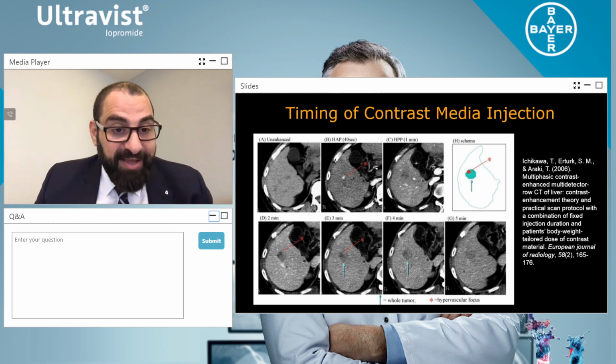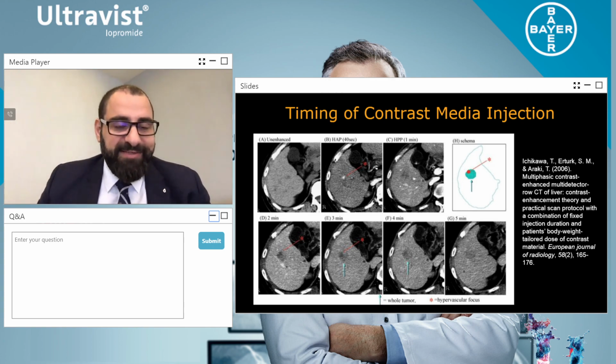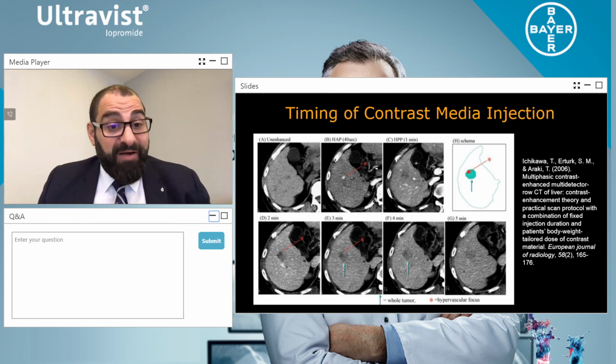I've just had another excellent question by Anil Pandit. Can we use 80 kVp? Absolutely yes. But remember, ladies and gentlemen, with kVp you have to use a weight-based approach. If I use 80 kVp, I only use this on patients that are like 70 kilos and below. Between 70 and 100 kilos, I use 100 kVp. Anything above 100 kilos, I'd always go 120 kVp.